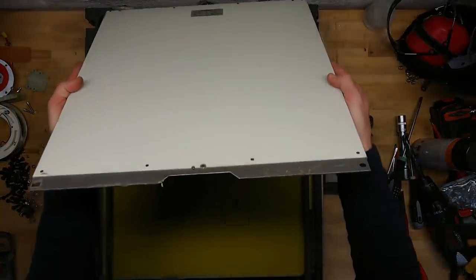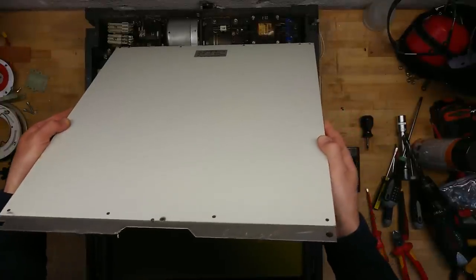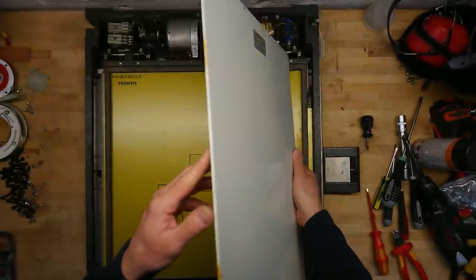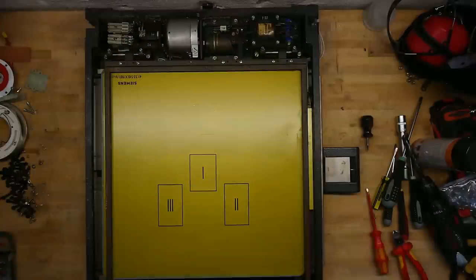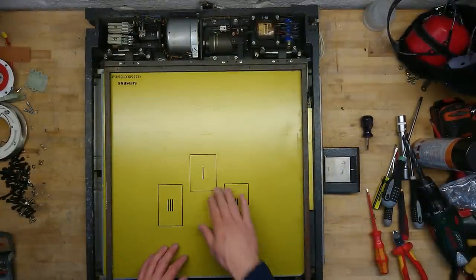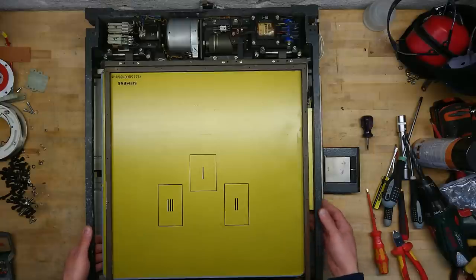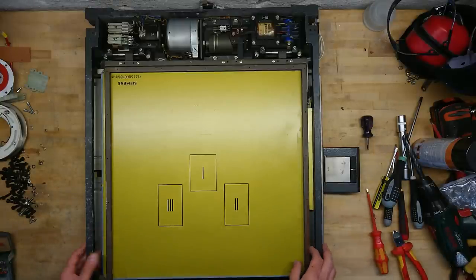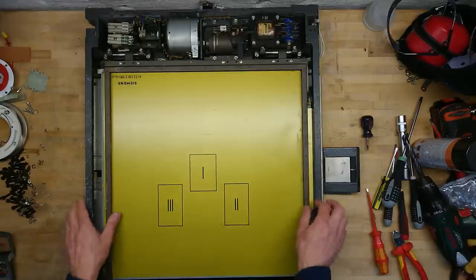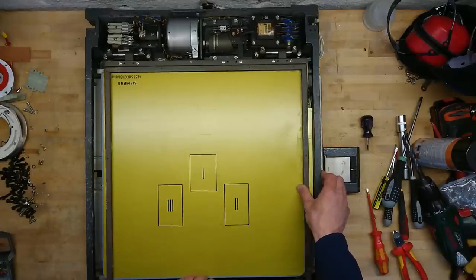I'm not quite sure if this has any lead in it. It sure is a very thin layer. But it says PB, so it should have it. Now that's interesting. 1, 2, 3. Now this is the part that actually has a connector on it. But it does not seem like it's supposed to go out in any way.